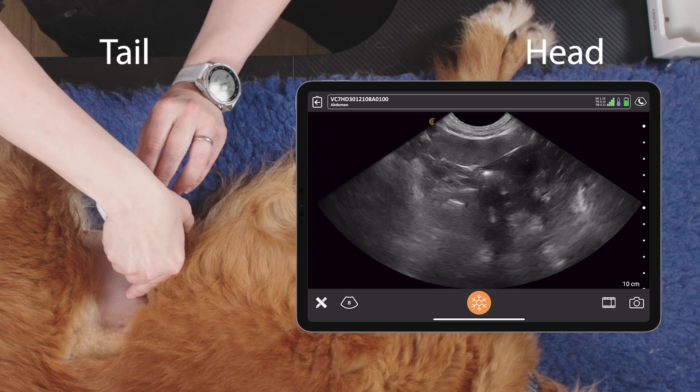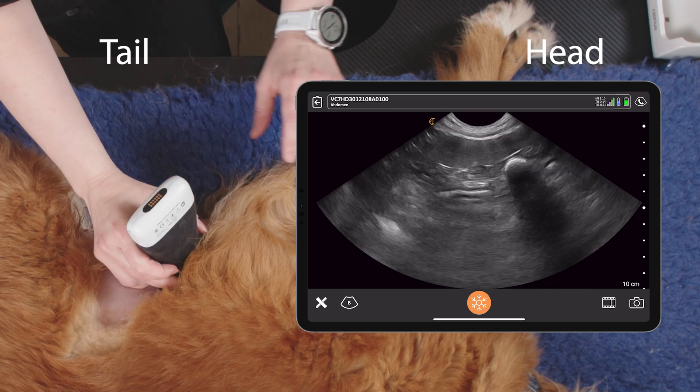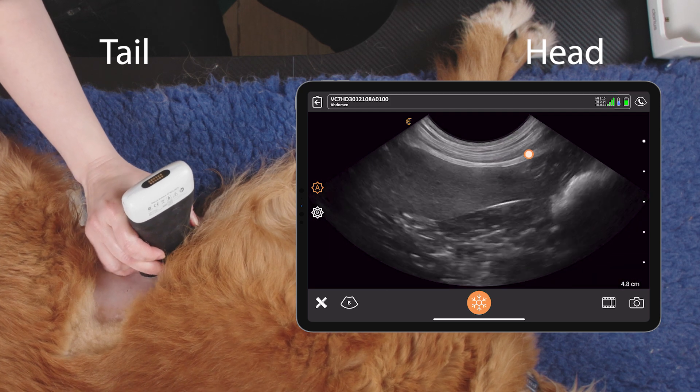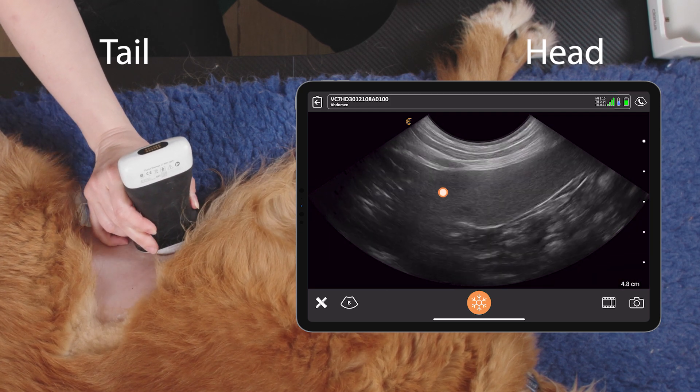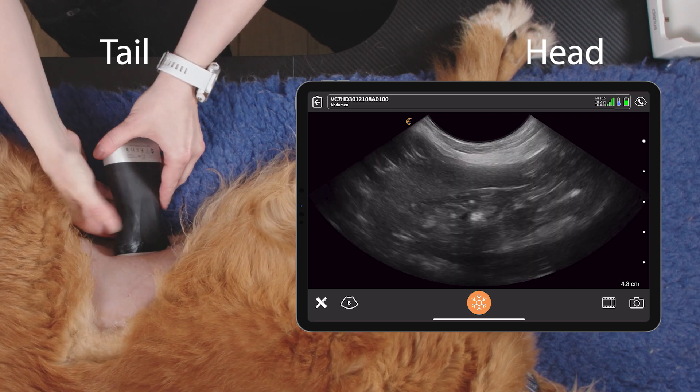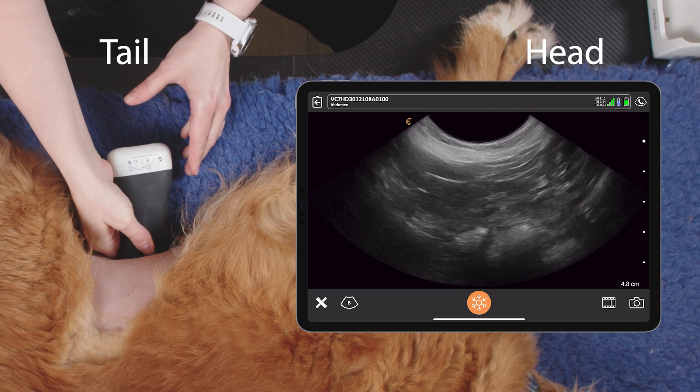We then want to lift the probe up so that we're seeing a narrow thin spleen, and follow the spleen in transverse all the way down to the tail of the spleen.